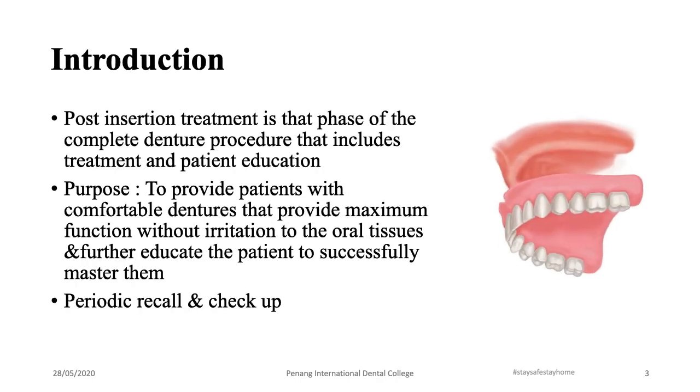So first thing is introduction. Basically, post-insertion treatment is that phase of complete denture procedure that includes treatment and patient education. So you will have to do some kind of minor adjustments. As long as your denture has not gone completely wrong, you might have to repeat certain specific procedures, or you might have to completely redo the denture.